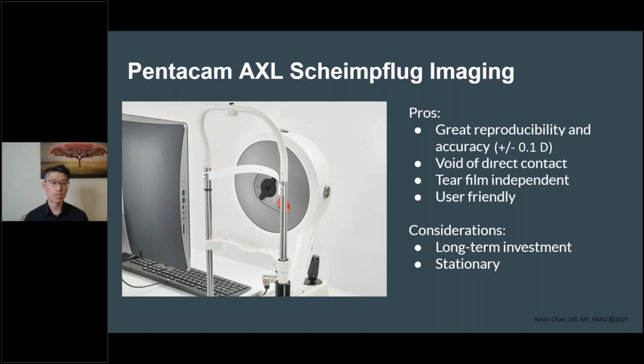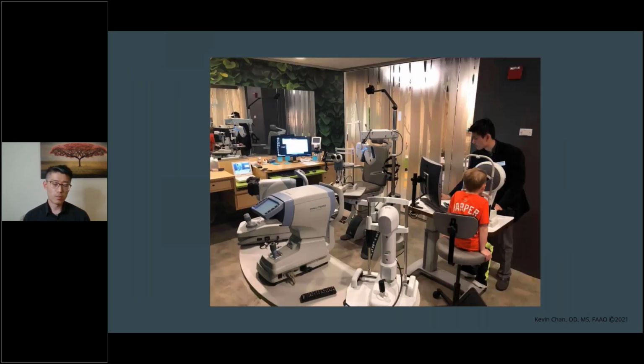But one consideration is that for clinicians having multiple offices or satellite offices, it may not be easy to transport the instrument back and forth. So it could also be a long-term investment for a clinician to consider, but it's definitely worthwhile if you want to be serious about treating myopia in a good way. This picture was taken pre-COVID, and I had the pleasure and some luck to deal with this 6-year-old patient, and he was very tame and very, very good with taking this picture.